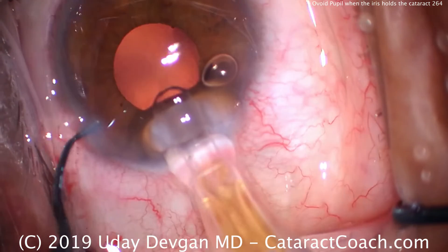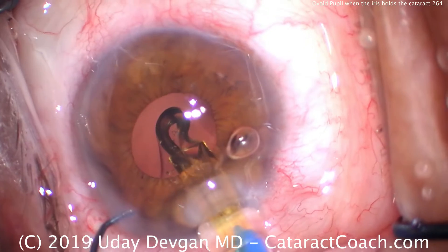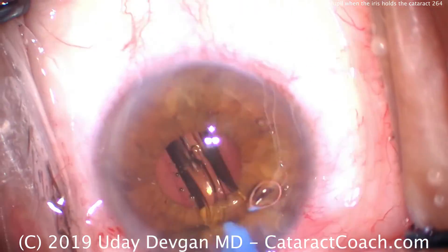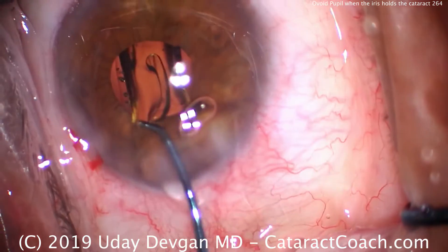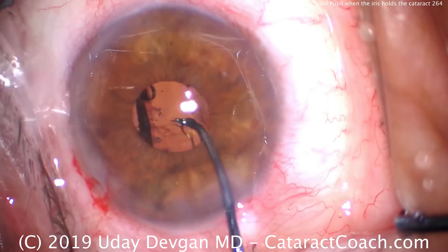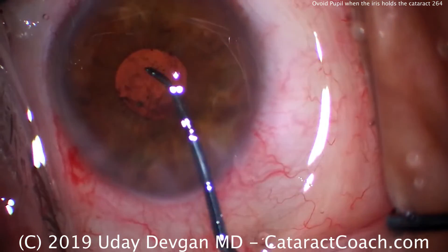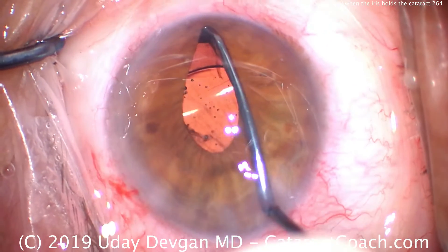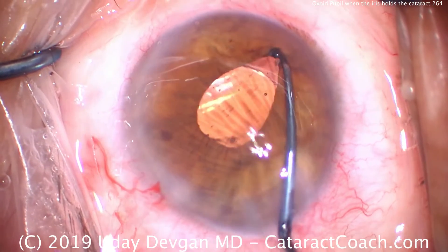At the end of the case we'll put the IOL in the capsular bag. It's important here to aim downward to make sure we go under where we know the nasal rhexis should be. For the trailing haptic, use the chopper and make sure it goes sufficiently deep in the capsular bag. Now with the pupil this small you can't really see, so while the eye is full of viscoelastic as the lens unfolds, use that chopper and we can actually lift up the iris — and there's the optic edge under the rhexis.